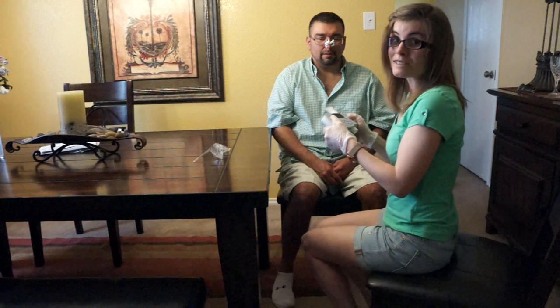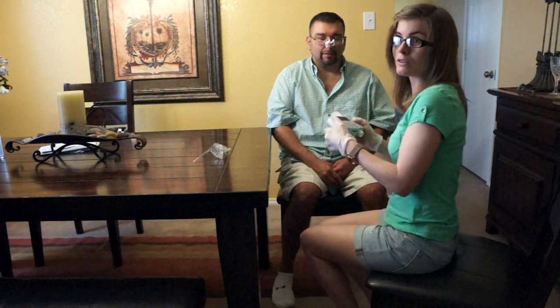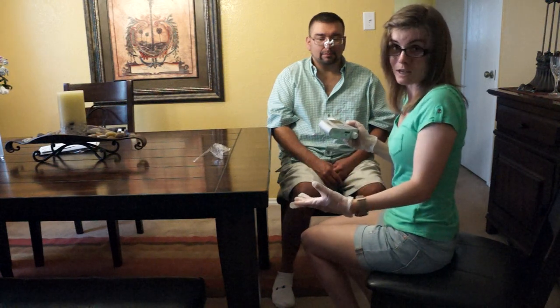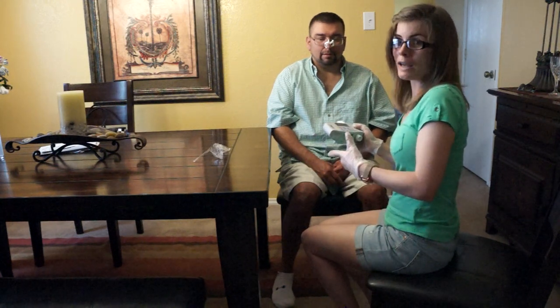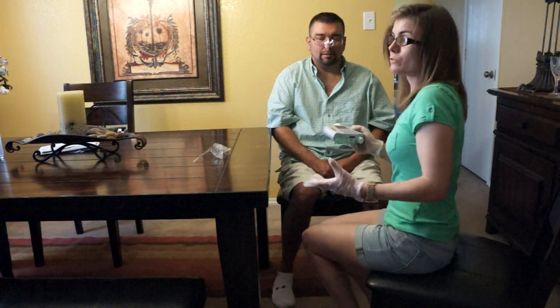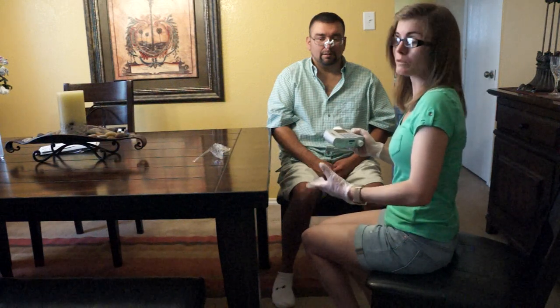Okay. If they need time in between tests, you give them that time. Because that lets them catch their breath, and second, you get a better test next time. So if they're worn out and not ready to do it, then you're going to get a poor effort on the next try. So make sure that you give them enough time between tests to do a good one the next time.